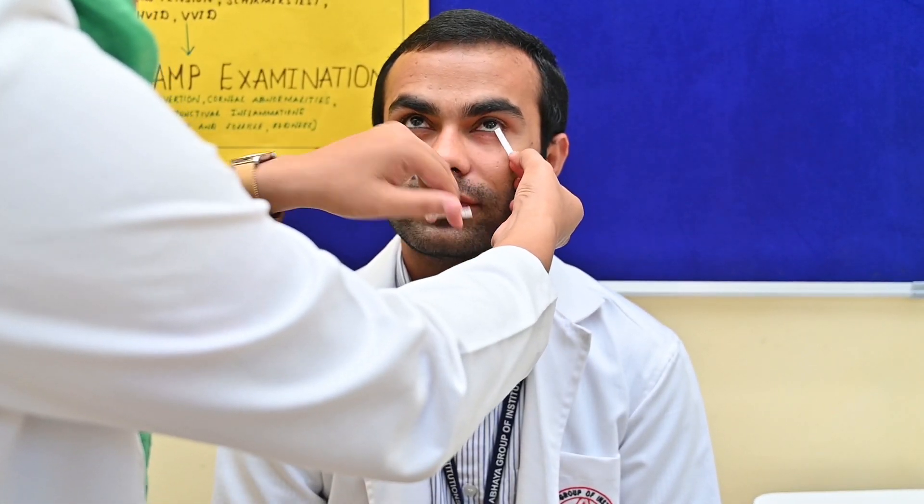So let's perform. The patient can look at infinity and relax. He can blink as usual. This is how you should place the strip. The test is performed basically in dim light, with fans and AC switched off.